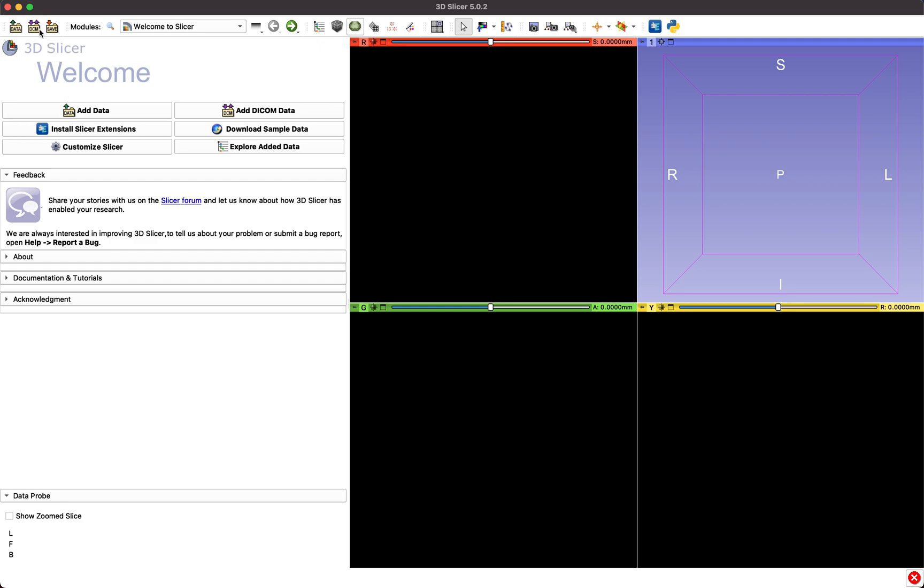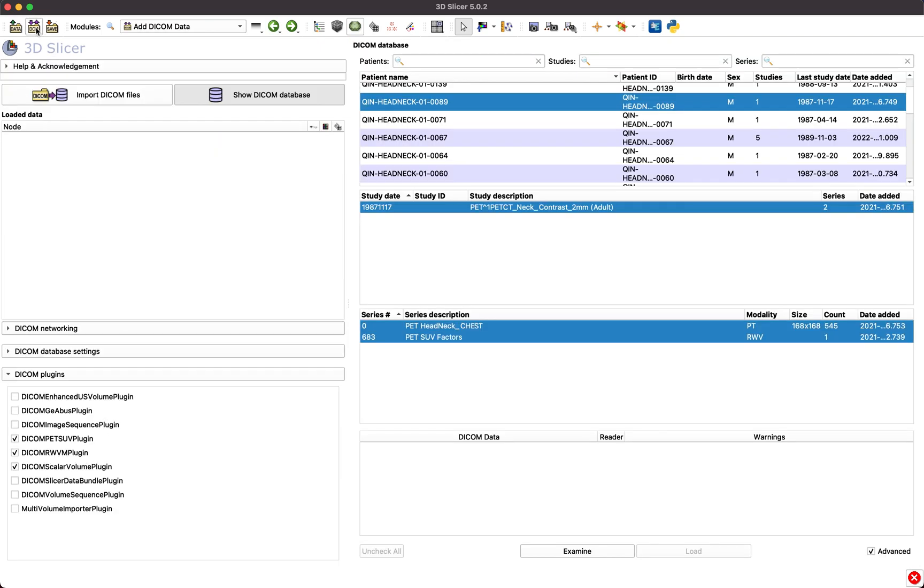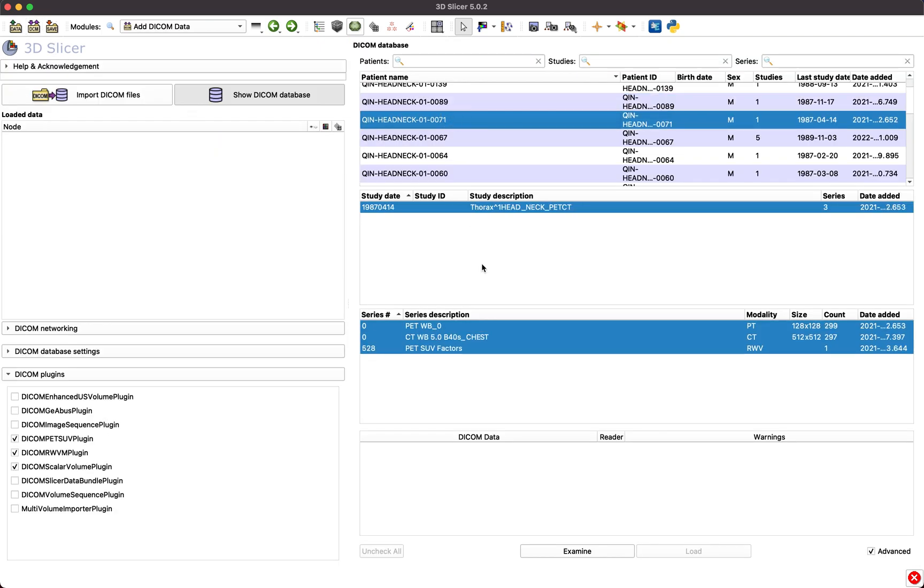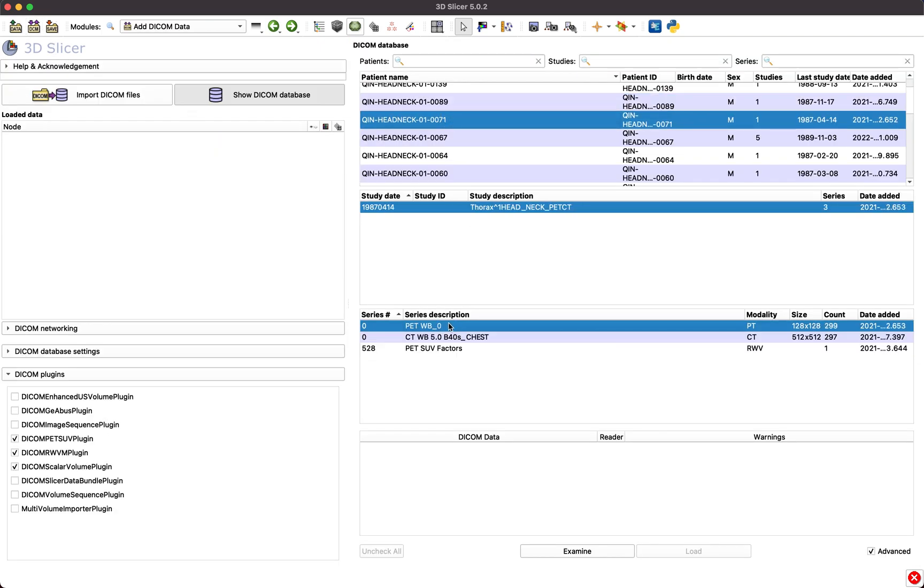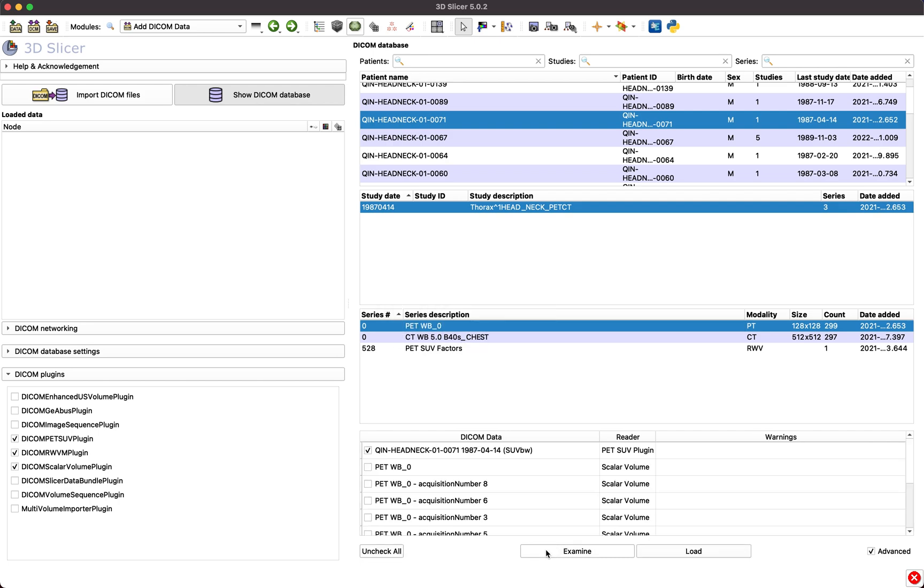Begin by loading the PET scan that you wish to analyze from the DICOM database. To load the dataset as SUV normalized volume, make sure that the DICOM PET SUV plug-in is enabled.